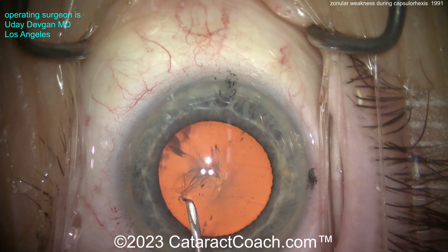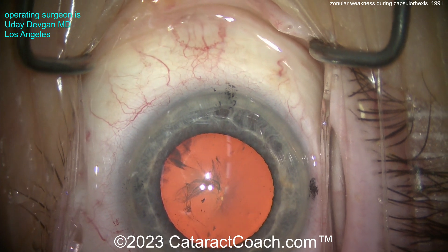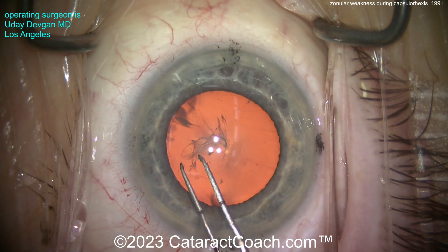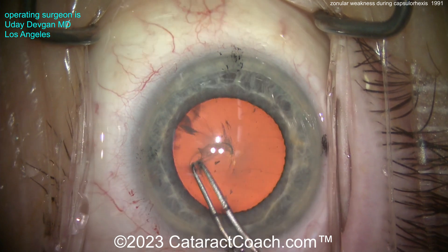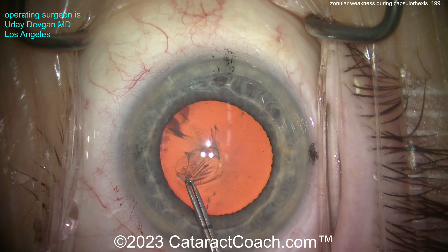There it is. By starting a rhexis with the forceps, I can always tell — is this loose or not? So it's an important hint. I did start off with the cystotome, which is nice and sharp, and obviously it's easier to penetrate the lens capsule with a sharper instrument.